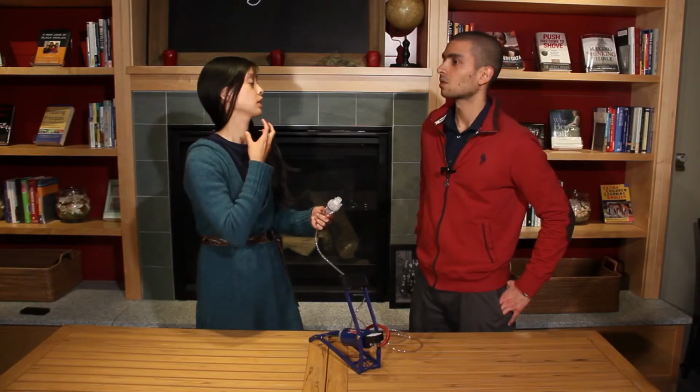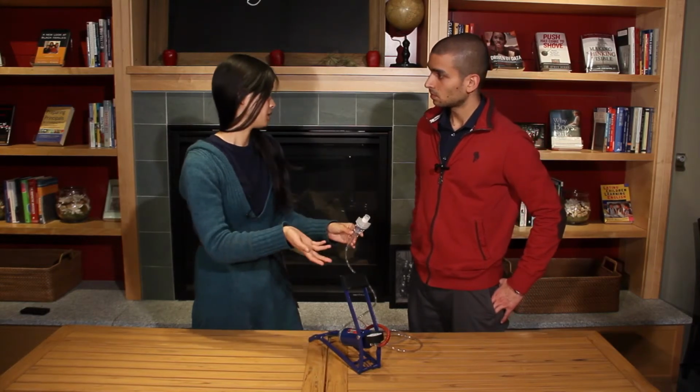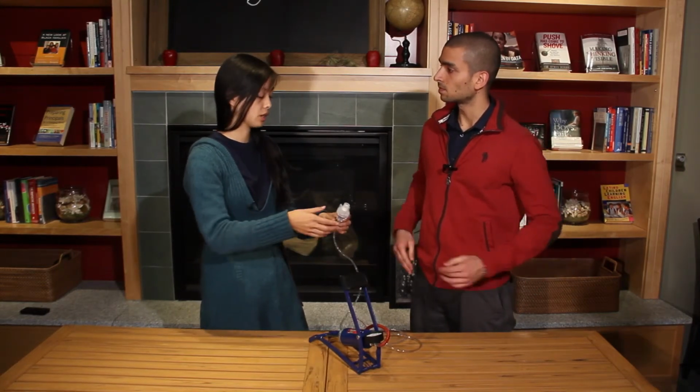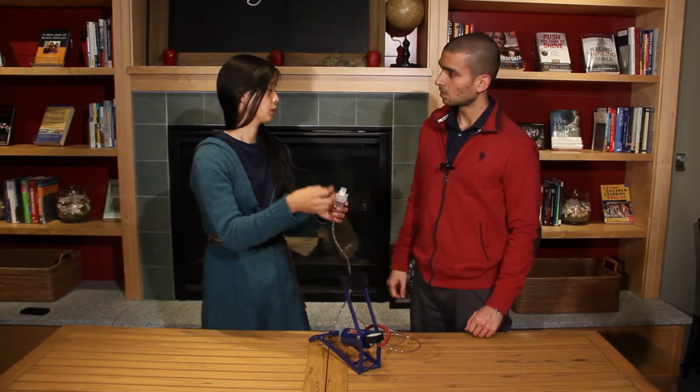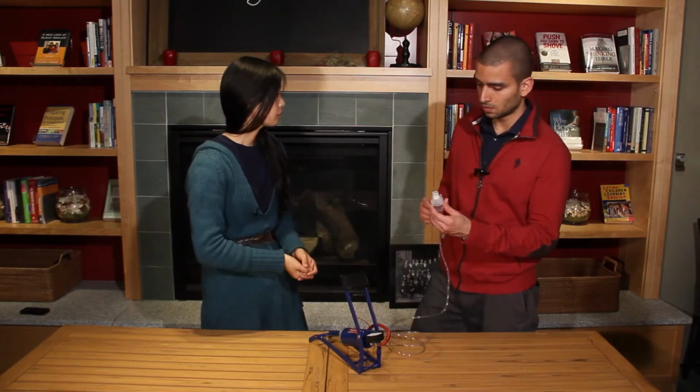Right, exactly. If you have asthma or other respiratory conditions, sometimes it's important to be able to convert the liquid medication to an aerosol that you can inhale so it's delivered effectively. Most of the machines that you would use if you had asthma here in the US are something that you would plug into the wall and it would turn the liquid medication into this aerosol for you to inhale. But in health clinics in Nicaragua, for example, some of those don't have access to electricity, and so we need an alternative because we have this constraint where we don't have that power source. How else can we make this into an aerosol medication so that people still get the medication that they need?